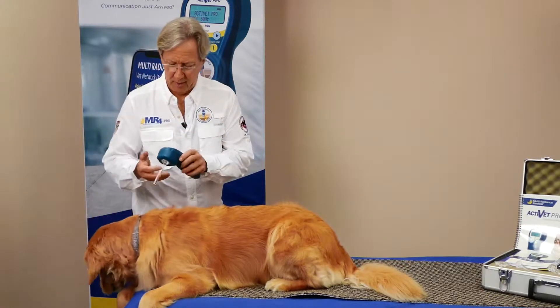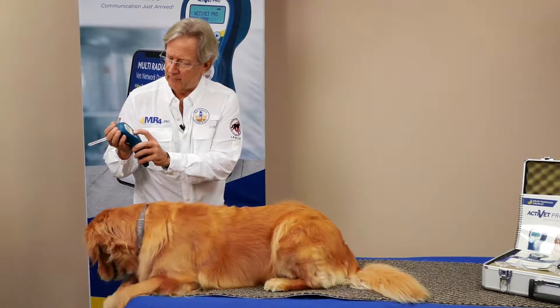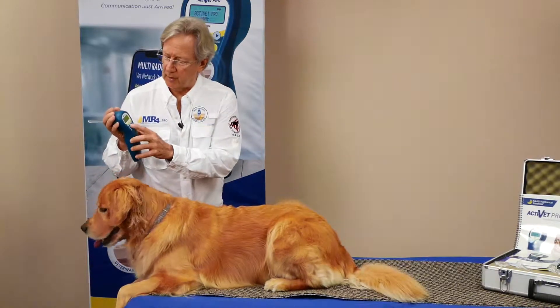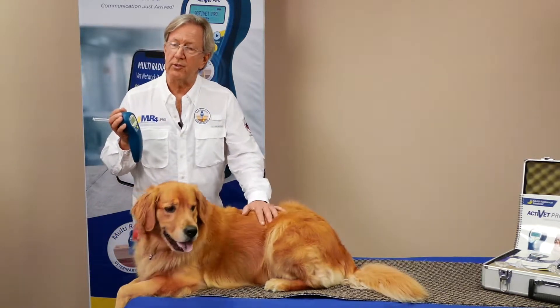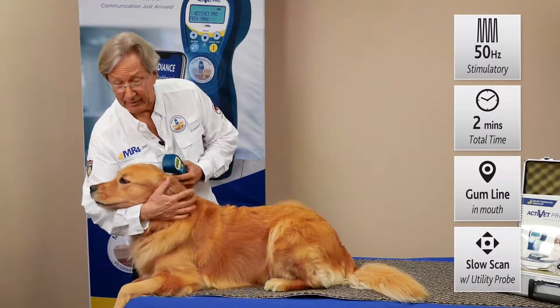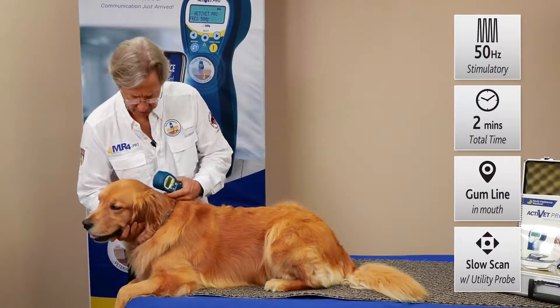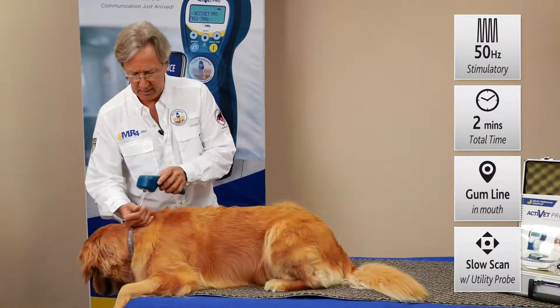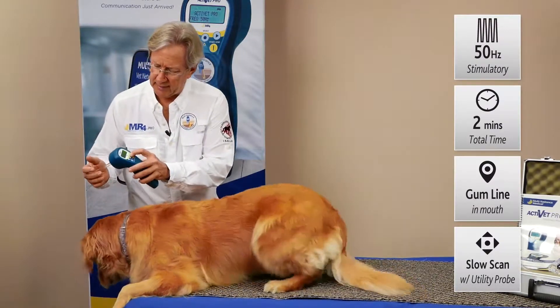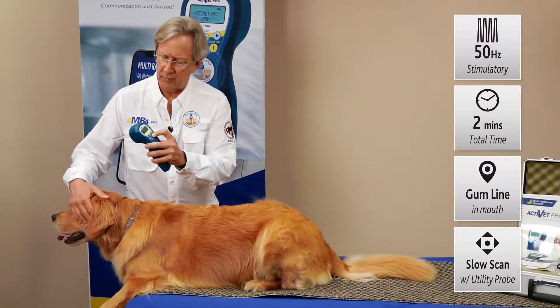This is our Activet Pro model. We've turned it on to Activet Pro — let's select that. 50 Hertz is a wonderful protocol to use; the frequency is great for reducing inflammation. You'll often be doing dentals in your practice and encounter gum inflammation, an extraction, or an infection. So at 50 Hertz, we'll push select, bump that up to two minutes, and then just push power.